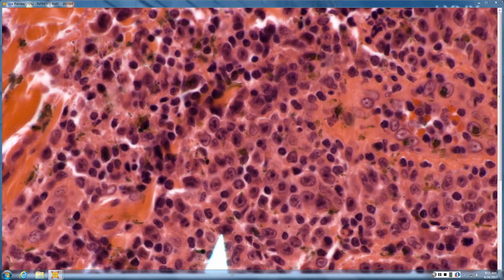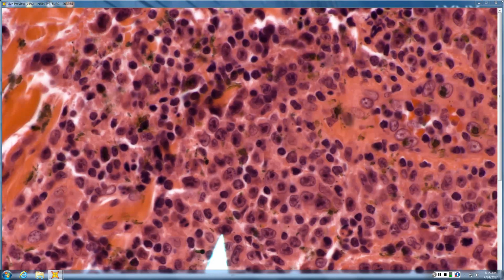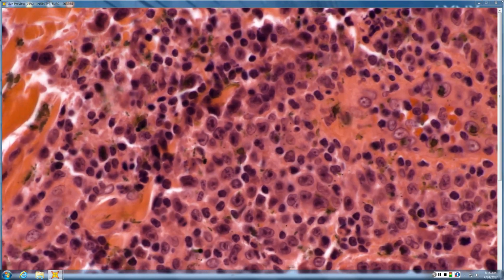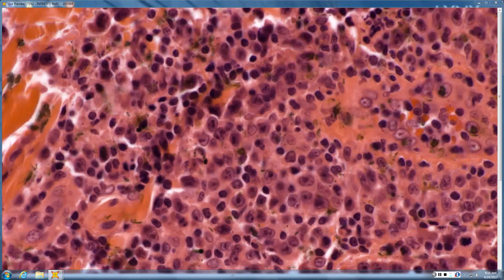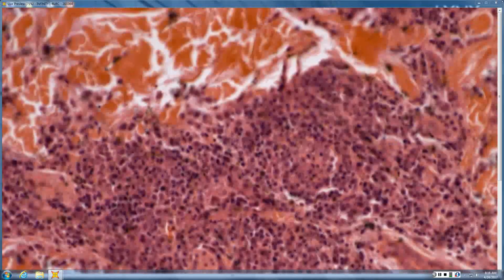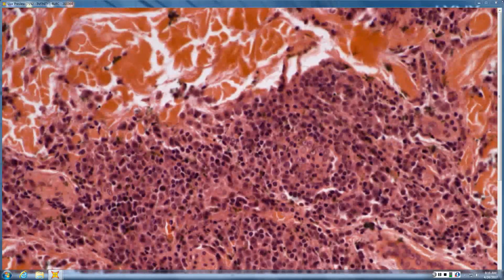Gray. So any stain you might want to pull out on this kind of cell? CD30. Yep. And it's positive, and not surprisingly, because you can see the sheets and clusters. So is this a bug bite? No. Primary cutaneous. Nor is it scabies, because that can give you plenty, but never in sheets and clusters. So could this be CD30 lymphoma, ALCL? Mm-hmm. Could it be lymphomatoid papulosis? How are you going to tell? Clinically. Yeah, exactly.